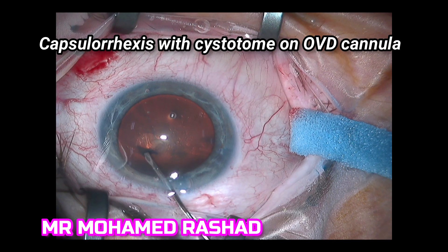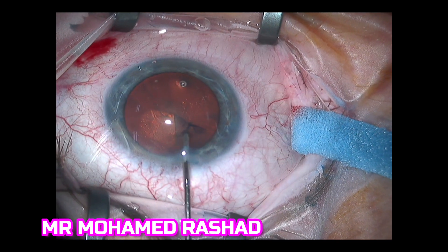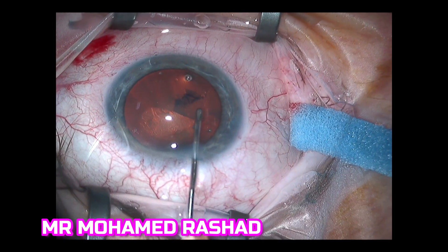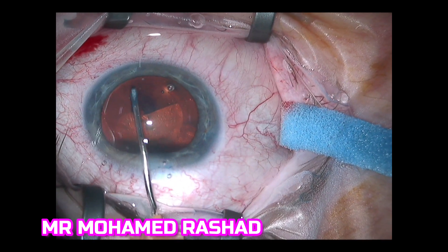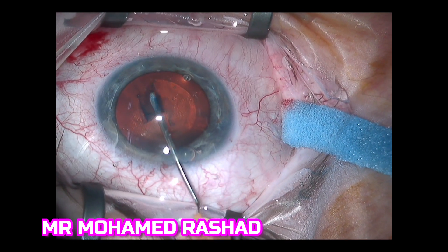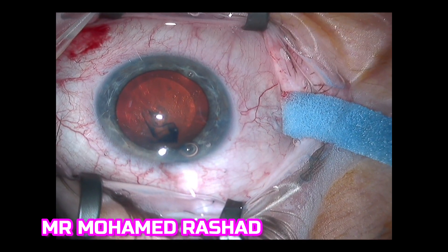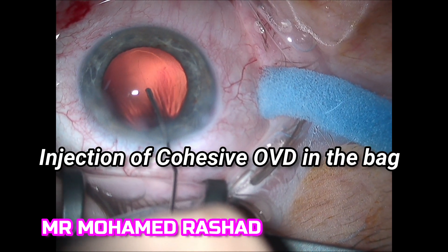From doing the capsulorhexis you have to design and keep in mind the lens that you are putting in. So we start our capsulorhexis as usual anti-clockwise. I usually inject every three clock hours a little bit of OVD. Then you go with the cystotome. I use mostly shearing forces only — it is more controlled.